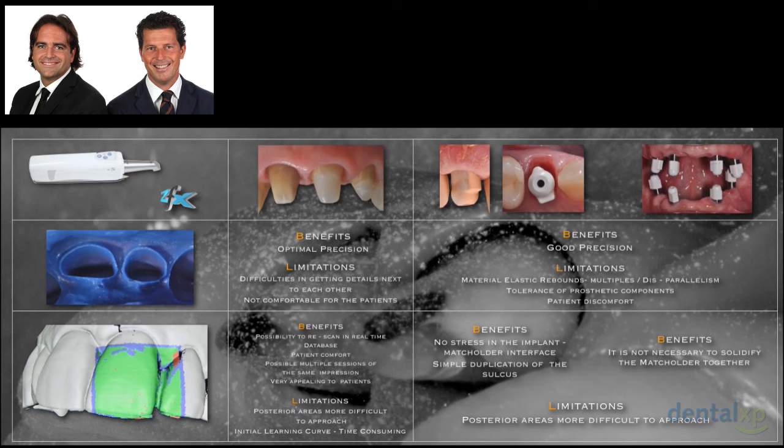So they start to look at you with different eyes when you start to explain that you're taking this particular impression that is digital, that is something new, and so in the eyes of the patient it's impressive, and this is something not to underestimate. Speaking about the implant restoration, one of the big advantages is that we can eliminate all the prosthetic tolerance that we have in the traditional implant impression.